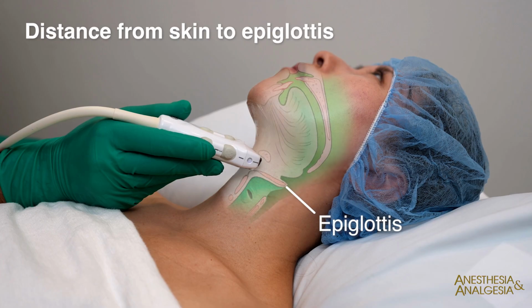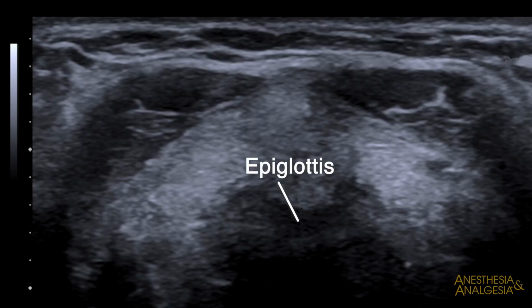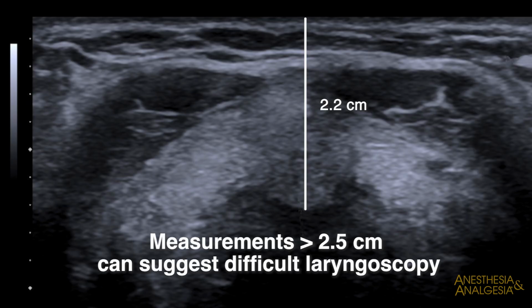To measure the distance from the skin to the epiglottis, continue to move the linear probe caudally and identify the epiglottis, which represents the mouth of the previously described face sign. Measure the distance from the skin to the epiglottis. Measurements greater than 2.5 centimeters can suggest difficult laryngoscopy.